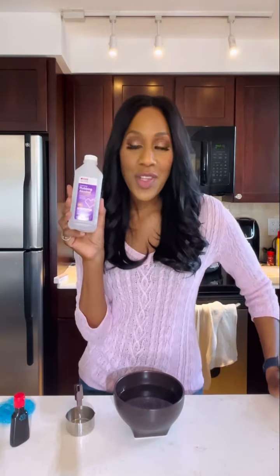It's super simple. First of all, you're going to need some isopropyl rubbing alcohol. Just rubbing alcohol. You want to make sure that it's 70% though. Second thing you need is some access to some water. Okay, easy peasy. I told you. I put some in a bowl here so I can have it handy. Also, you want a measuring cup, okay? At least a measurement unit.